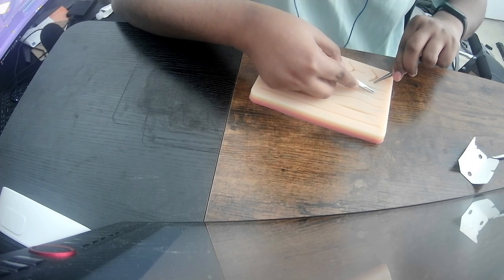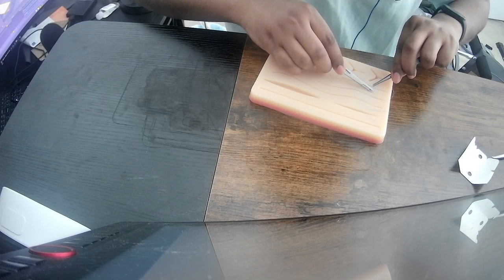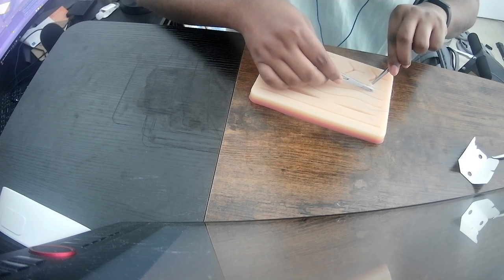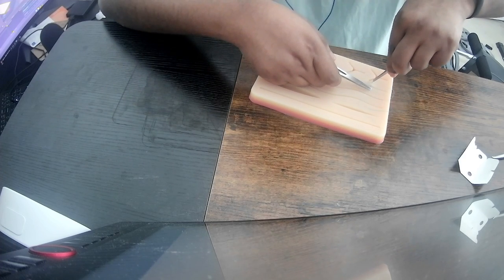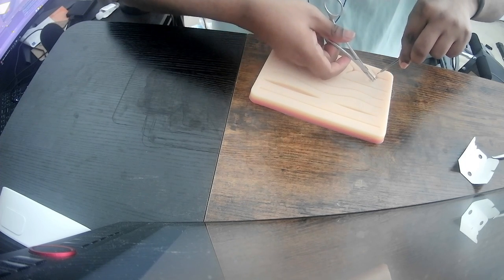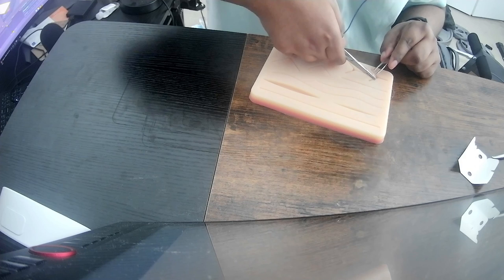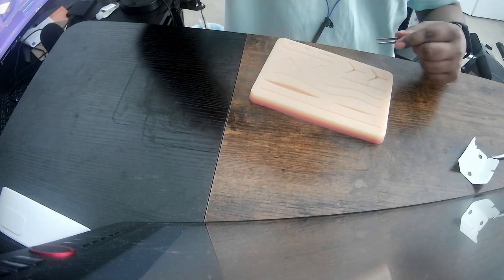Oh no, I went too deep, too far. I don't know if that's too far or not. Plus, I think I messed up the angle. Let's try to grab the needle. Yeah, it seems like the angle I hold it in matters a lot in the difficulty of throwing those sutures. And also depth perception. Okay, locked. Let's try. I think this will be a good one.